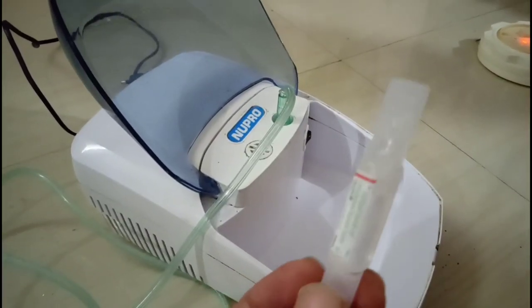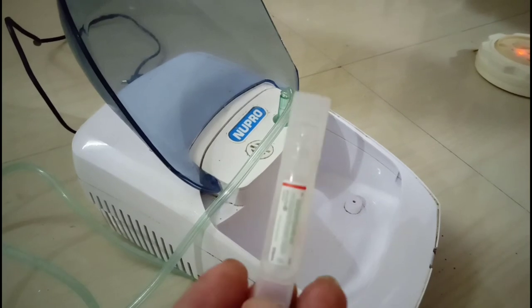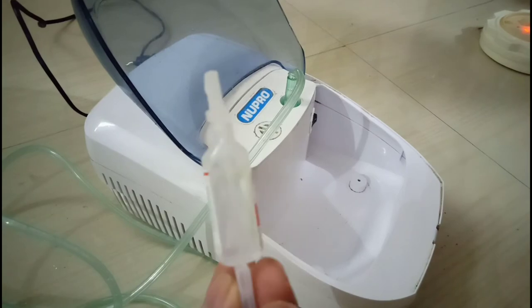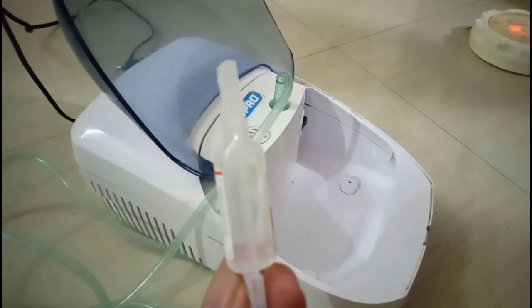This is duolin respules — it contains levosalbutamol and ipratropium bromide. We are to open it and pour the medicine into the medicine cup.